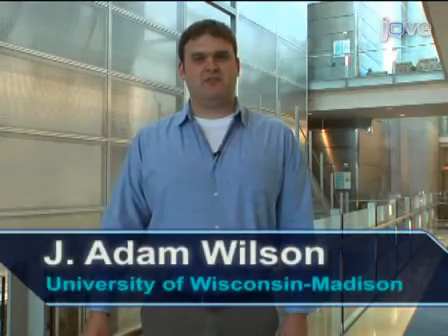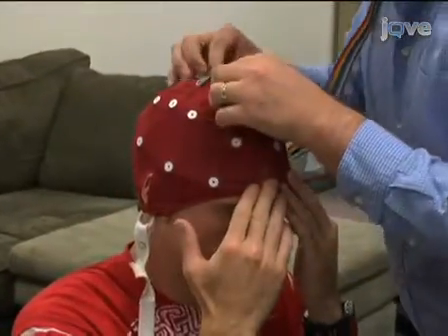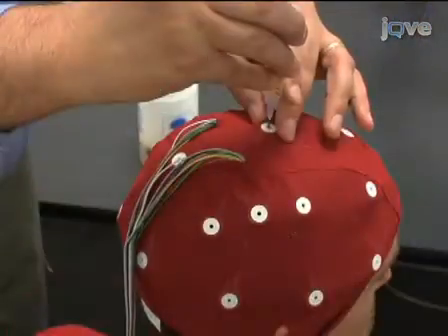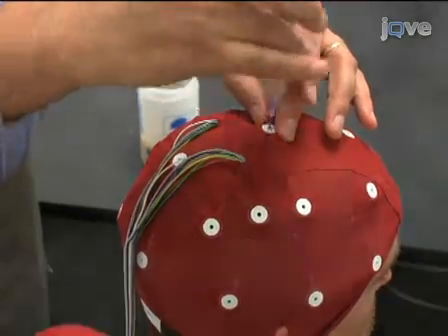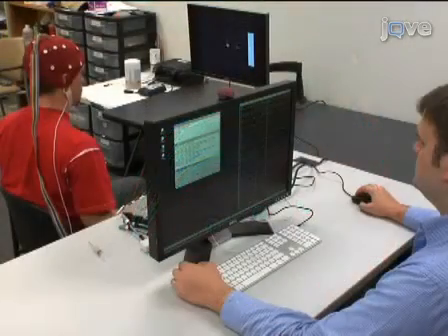Hi, I'm Adam Wilson and I work in Justin Williams' lab in the Department of Biomedical Engineering at the University of Wisconsin-Madison. Today, I'll be showing you the procedure for recording brain activity called the electroencephalogram or EEG for controlling a Brain-Computer Interface application. So, let's get started.